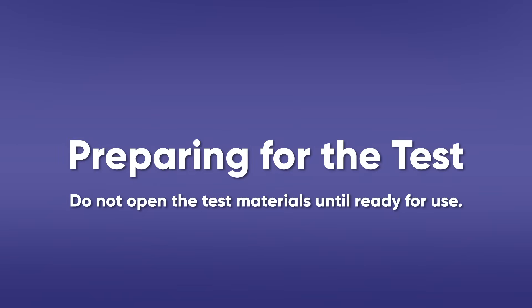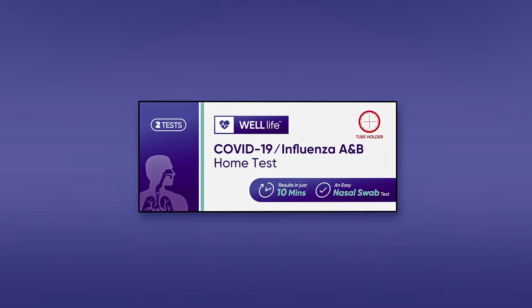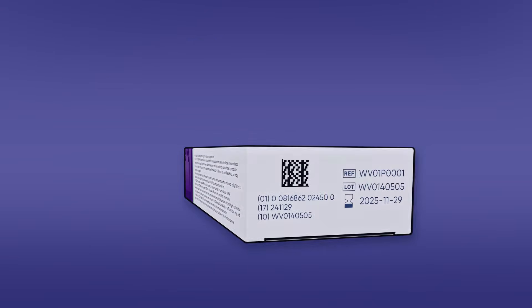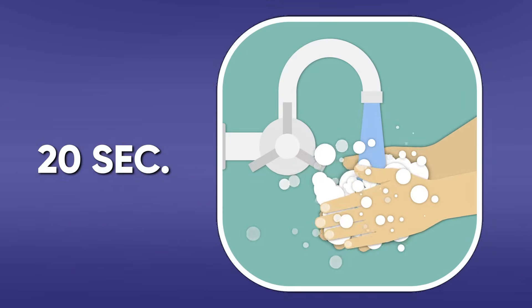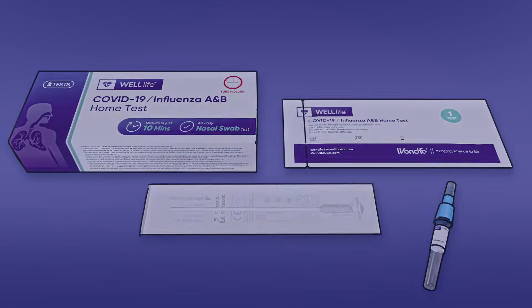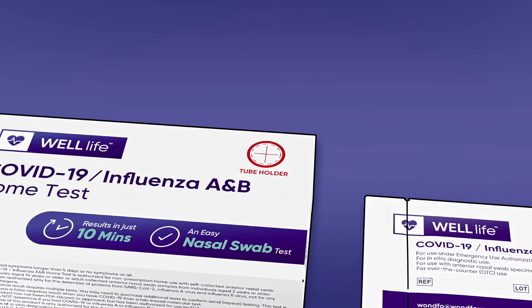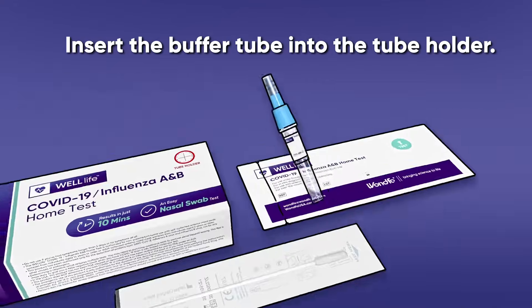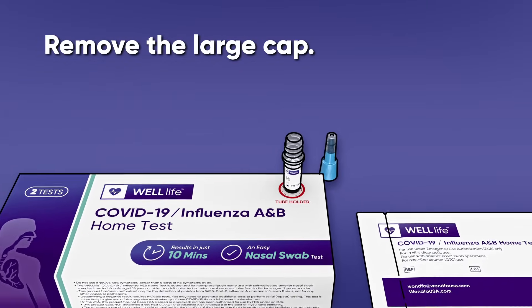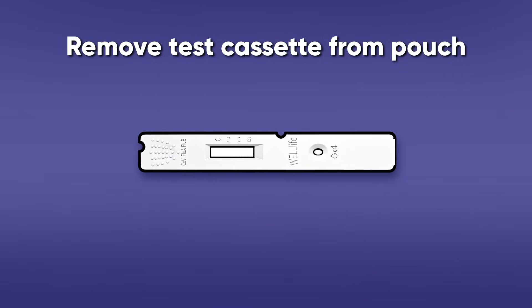Preparing for the test: Do not open the test materials until ready for use. If the test cassette is open for an hour or longer, invalid test results may occur. Check the expiration date printed on the right side of the outer box. Wash your hands with soap and water for 20 seconds and dry them thoroughly, or use hand sanitizer. Locate the tube holder on the box — look for the red circle on the kit's box. Insert the buffer tube into the tube holder and ensure it is stable and upright. Remove the large cap from the buffer tube and set it aside for later use. Remove the test cassette from the sealed pouch and lay it on a flat surface.